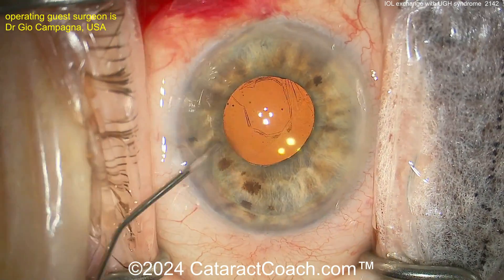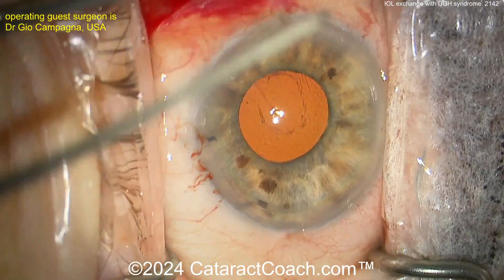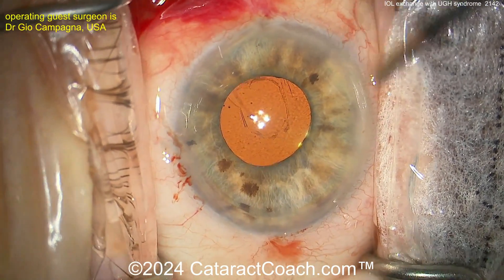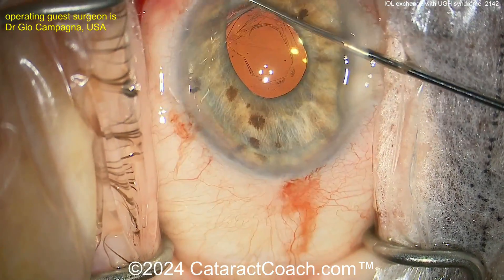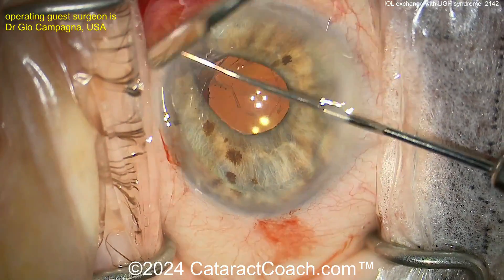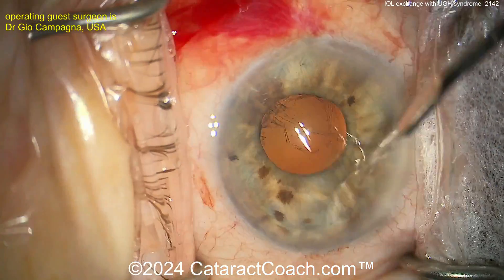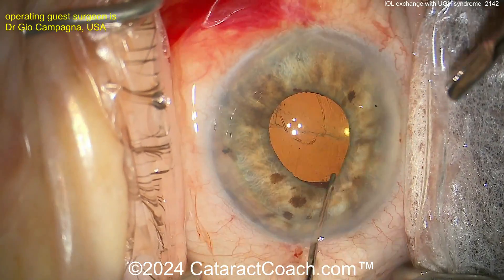It can be a micro hyphema — it doesn't have to be a big red hyphema. In this case, you have those thick arms of that single-piece acrylic lens scraping the back of the iris. Here we go dissecting that lens up. You can see it is just sitting right there on the sulcus. This is something you should not do. Please don't place a single-piece acrylic lens in the sulcus.